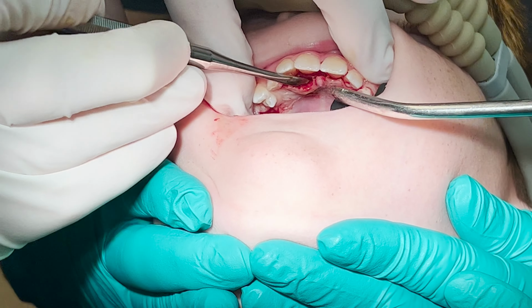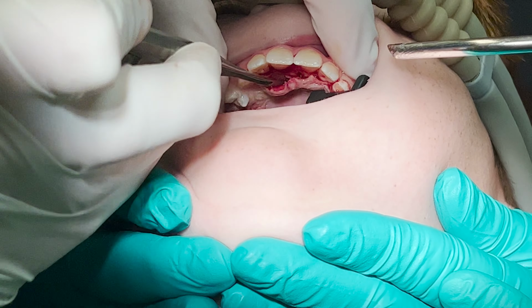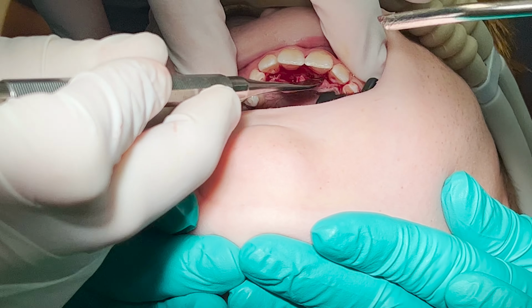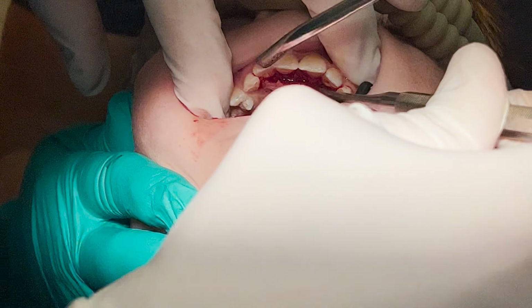As I'm elevating this flap, I'm starting to see the bone come into view. Access is really important with this. I don't want to shortchange myself by making too small of an incision, but I don't want to go too big because it's going to cause more post-op discomfort.